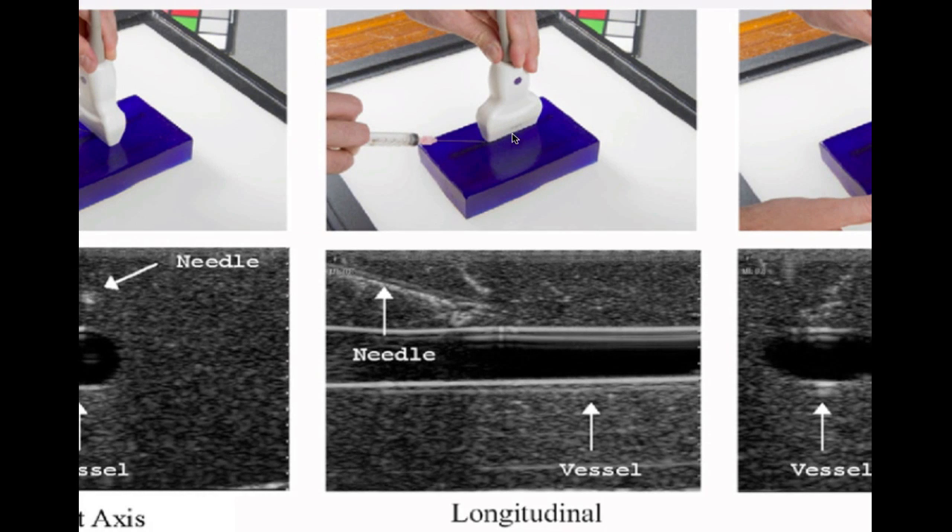Contrast this to the longitudinal approach where we've rotated the probe 90 degrees and we look at the vessel lengthwise — the needle goes in-plane with the probe. What's great about this technique is that we allow ourselves visualization of the needle continuously going into the tissue. That's advantageous because a lot of the time we wind up putting the needle too deep and going to the back wall of the vessel and often deeper into structures we don't want to hit. So if we can watch the needle continuously, that's a great thing for patient safety.